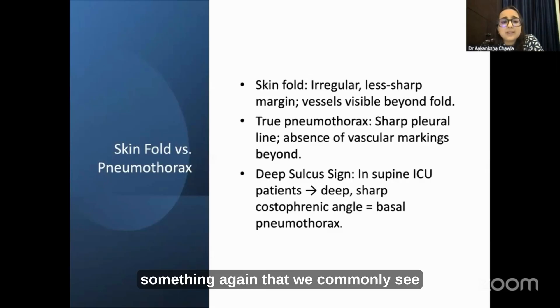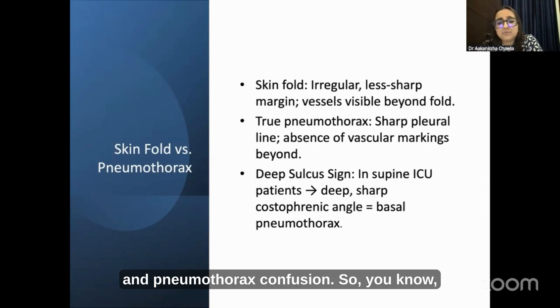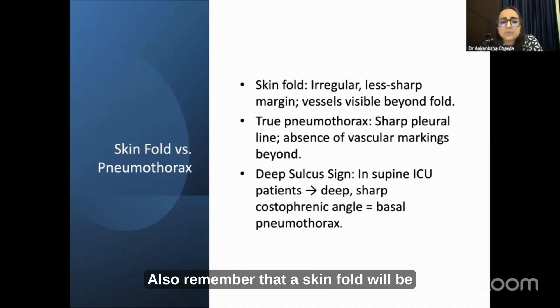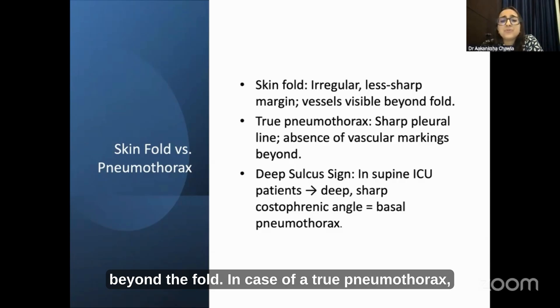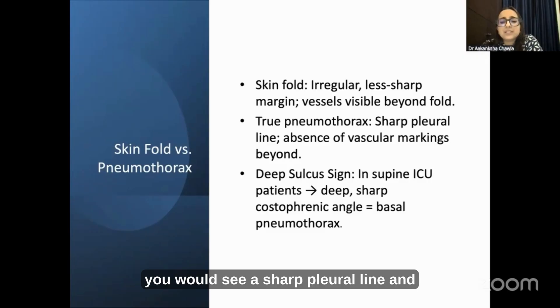Something commonly seen in regular practice is confusion between skin fold and pneumothorax. It is not very difficult when you use a systematic approach. Remember that a skin fold will be irregular, with less sharp margins and vessels visible beyond the fold. In the case of a true pneumothorax, you would see a sharp pleural line and absence of vascular markings beyond.